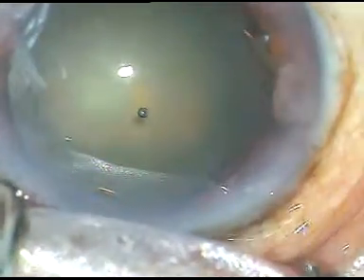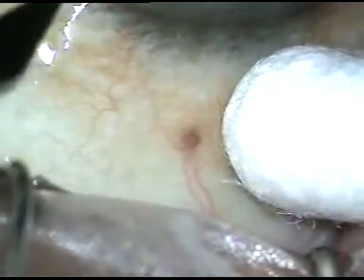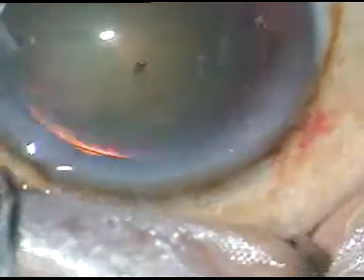The main incision has been made, viscoelastic substance has been injected into the antechamber, one side port has been made on the right side of the main incision, and this is another side port on the left side of the main incision. This is an unedited phacosurgery. Now capsulorhexis is to be done.